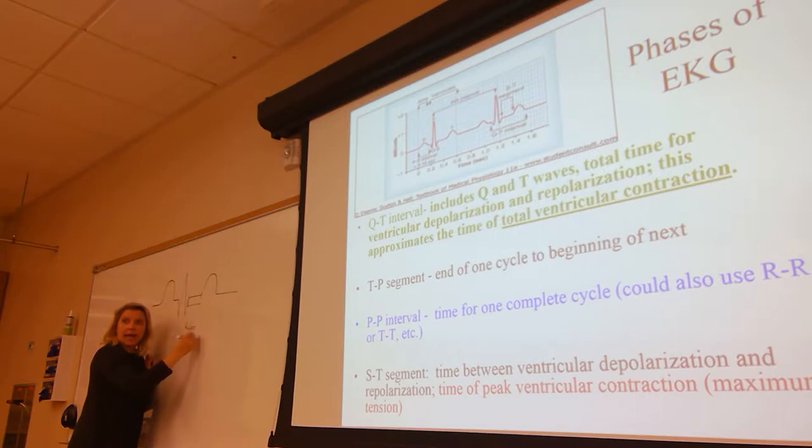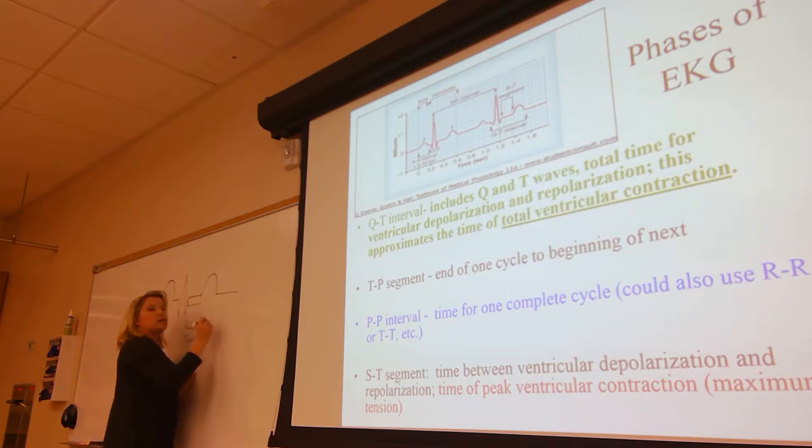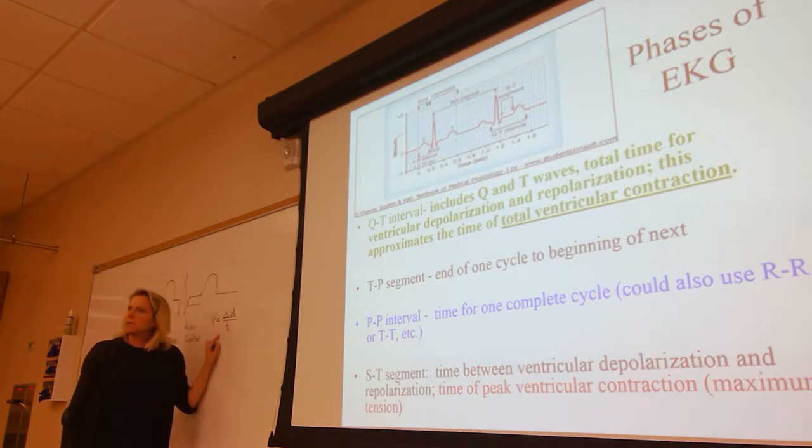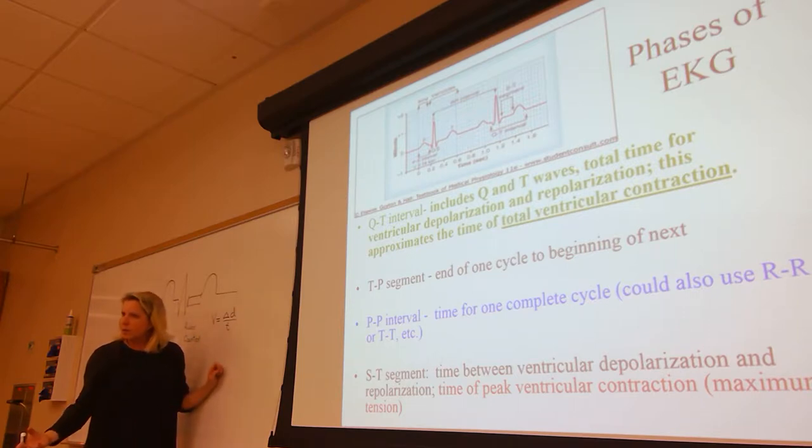Remember, I warned you I'm going to have to shrink to fit. And so the dimensions are not going to be true. But you assume if you're counting those dots in those boxes that the dimensions are still okay. You remember that? Juliana then uses the following equation. V equals change in D over time. Where did you see this before? Lab unit one, the first 20 pages, when if you knew two of the three variables, you could rearrange to solve for the third. Do you remember that?